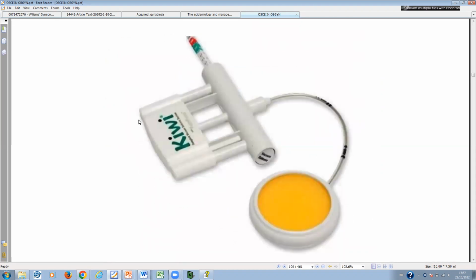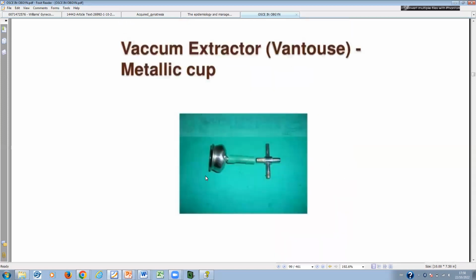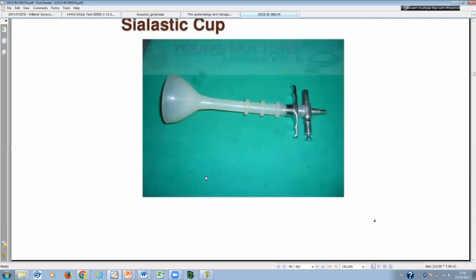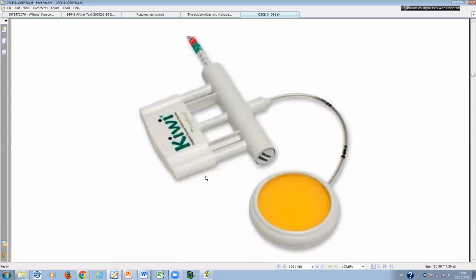It's a Kiwi. It has a safety mechanism with a color code: as I apply the pressure, the green marks the safety area. By the time you are going to the red, it means that the pressure is getting too much. So this is what we use now, instead of this metallic or plastic cup connected to the suction tube. This one is self-regulated. So this is also a Kiwi vacuum.